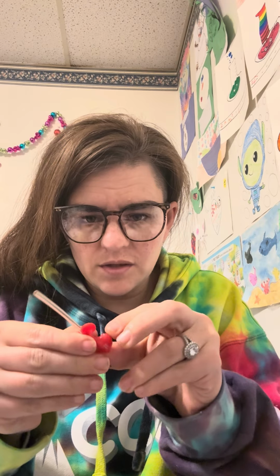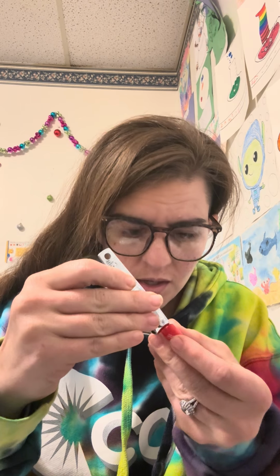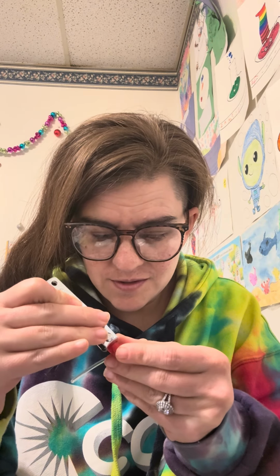So I think I've got mine. You can always feel it to see if it's going to be in your ear nice and comfy. So I think I need to cut one little bit more, and then we can move on to the next step. All right, got it. Perfect. Now, the next step is measuring.